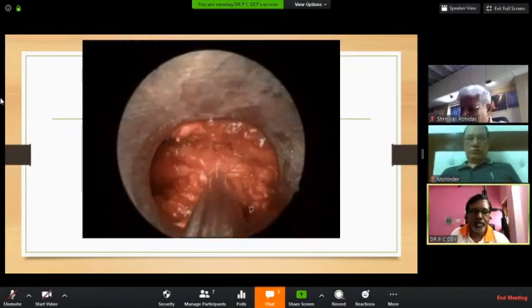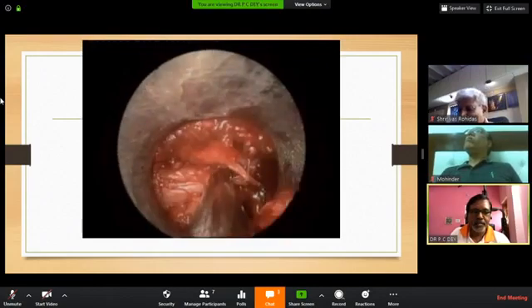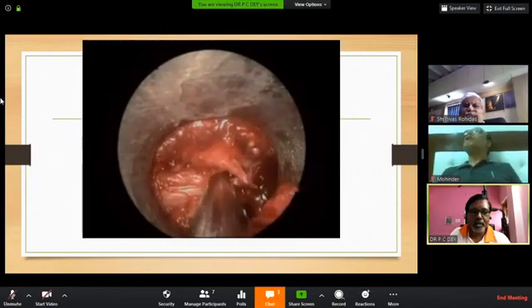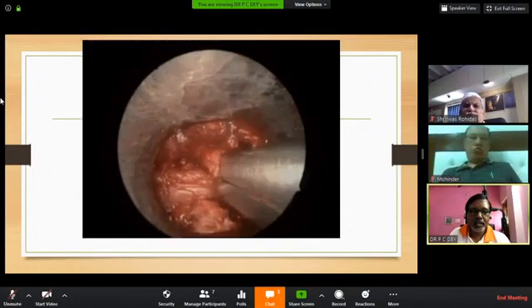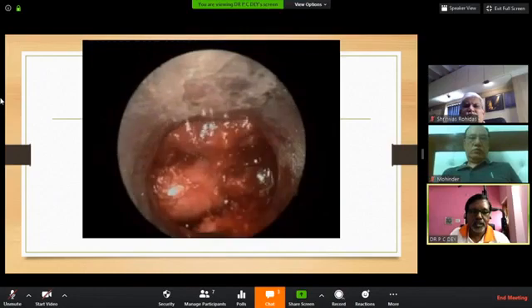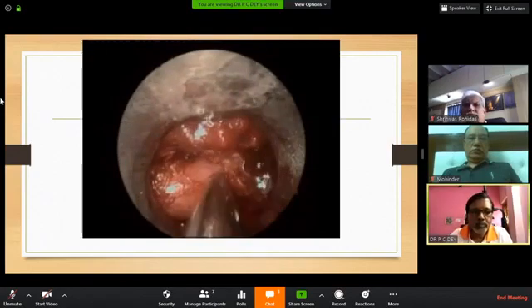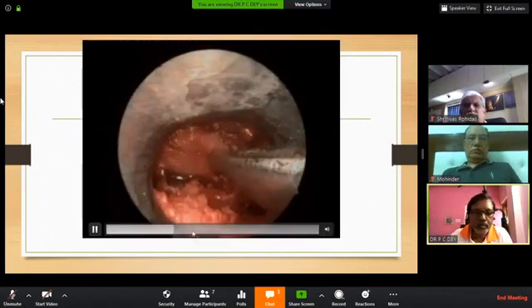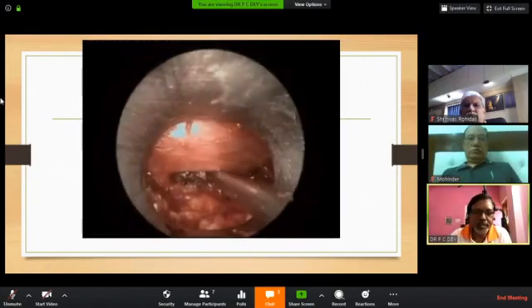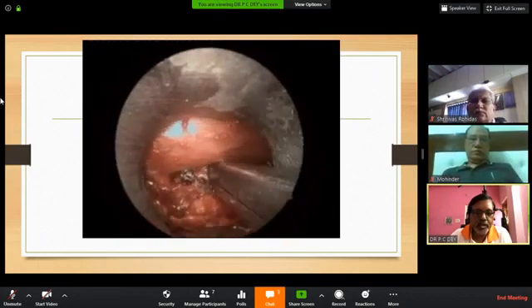And this is your traversing nerve root. This is the midline. We are just decompressing a little bit of the midline, and then gradually coming from midline to the inferior lamina and decompressing the neural tissue up to the foramen, the inferior foramen. So this is up to the foramen almost, and the traversing nerve root is clear. Then this space is in front of you, and then we have to search for the extruded part of the disc, which is almost cranially migrated.